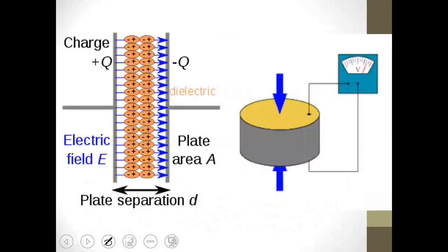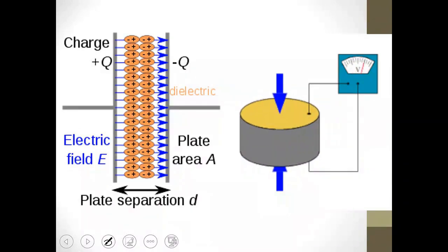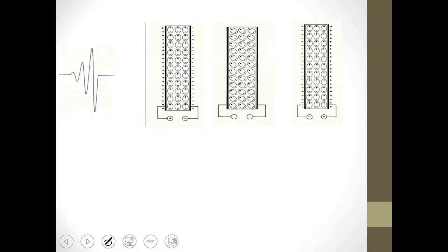Now, let's see how the idea works. If we open the cover of the probe, we will find that there are elements inside, which I call crystals. There is something called piezoelectric material. What does piezoelectric material mean? It means that right now, I want to do something. I want to take a specific material and apply mechanical effects to it, or change its motion, or alter its dimensions very rapidly. This change results in ultrasound. Here is the probe, for example, in this shape. So I have the probe in relation to me.